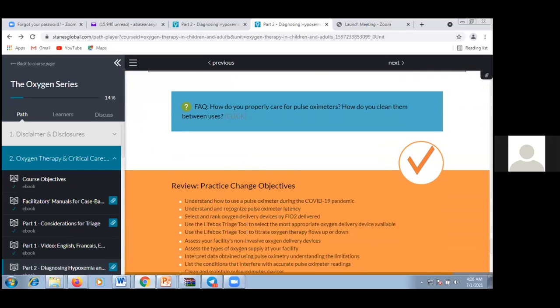Using that, you can wipe the pulsox monitor as well as the probe. Each time you are cleaning your pulsox device, remember to wash your hands before touching it, and also after cleaning and touching it. I think this is the message, and please take care of your pulse oximeter, as it is a delicate device.